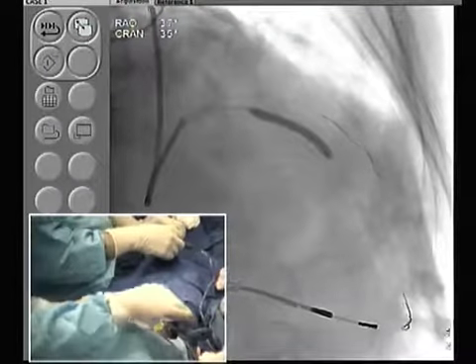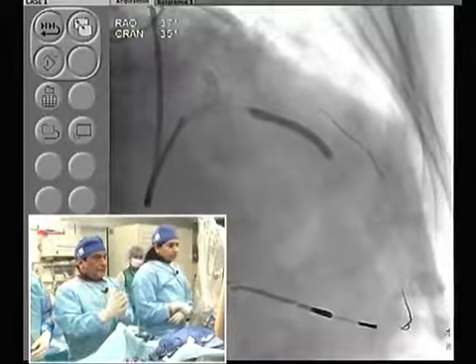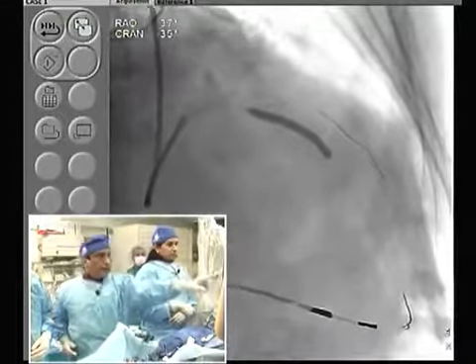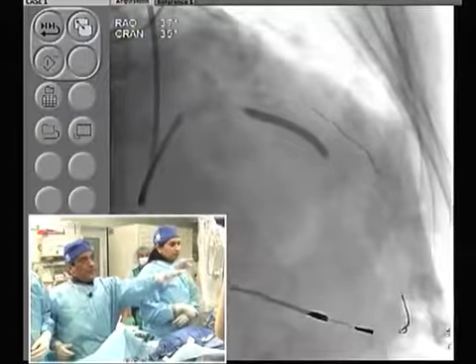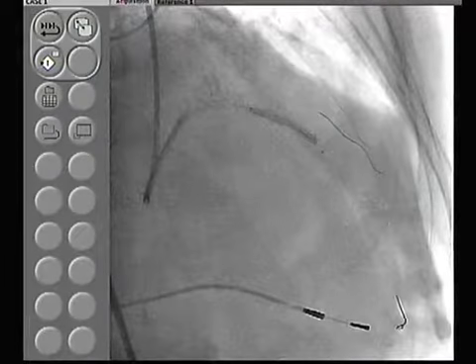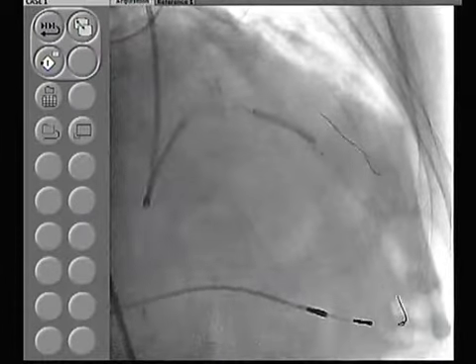In this case you saw the calcium at the level of the pacemaker, although the picture is overlapping. Once you see that angiographic calcium in the Mount Sinai Cath Lab, I cannot say 100%, but close to 95% of cases will get a rotational atherectomy before putting a stent.